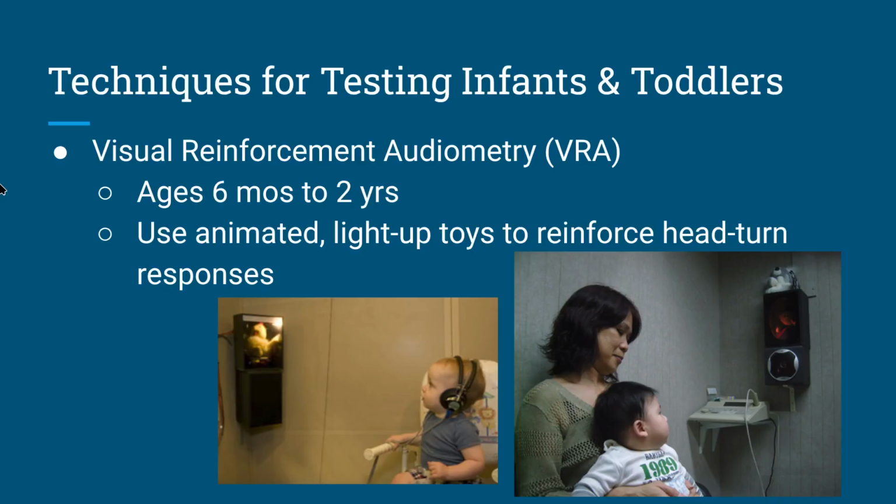Remember, unilateral hearing loss like otitis media with effusion could affect this, so don't stress about it. Always best to try with earphones when possible. Bone conduction testing is appropriate with the pediatric headband and when time allows, especially if you have an assistant. The assistant's task is to keep the child's attention centered and forward so that they're not looking at the toy reinforcer.